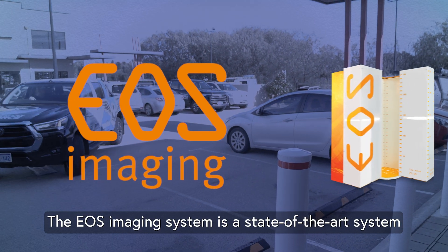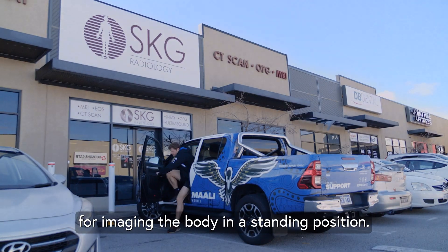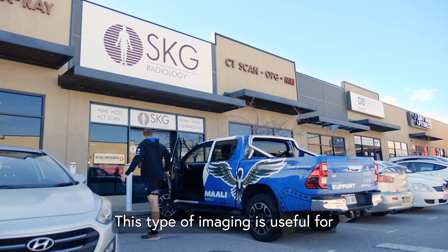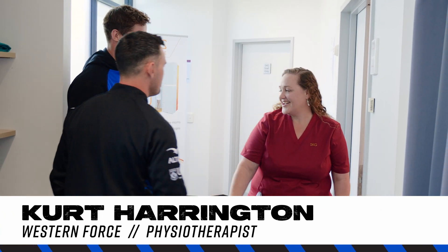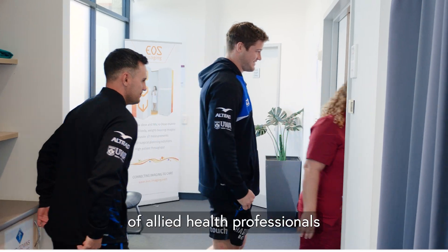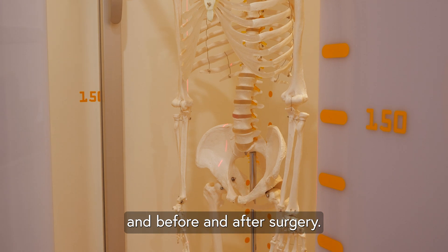The EOS imaging system is a state-of-the-art system using low-dose x-ray for imaging the body in a standing position. This type of imaging is useful for GPs, surgeons, physiotherapists, chiropractors and a range of allied health professionals to assess postural alignment prior to treatment and before and after surgery.